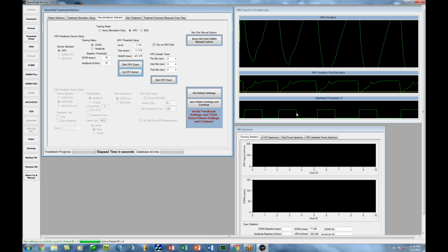Now these should be pretty close to being evenly separated. As long as they correspond to the actual edge of the heartbeat, it's picking it up the right way. We call this the picket fence. If you see it like this, it's calibrated correctly.